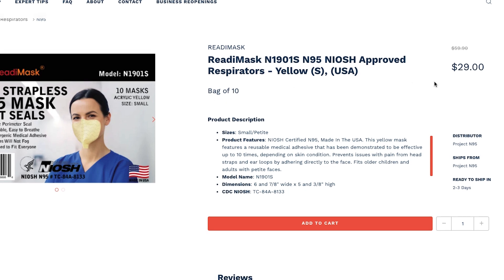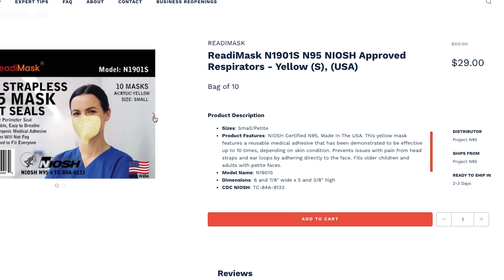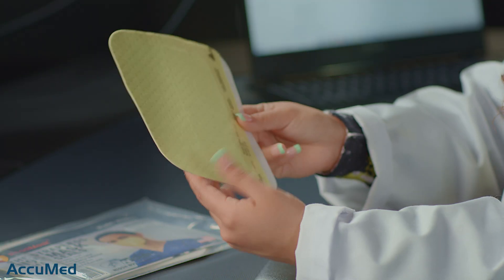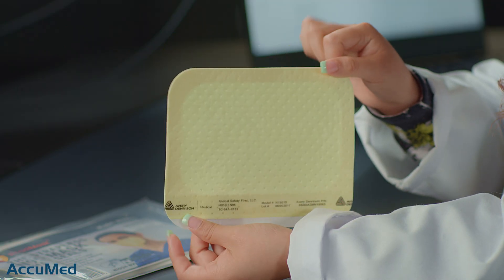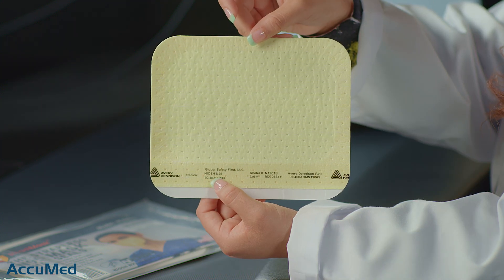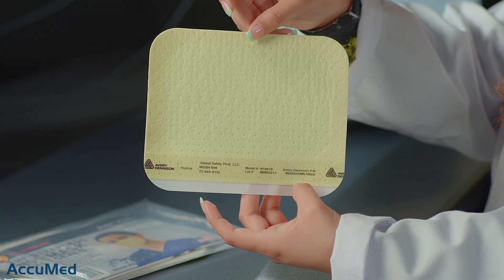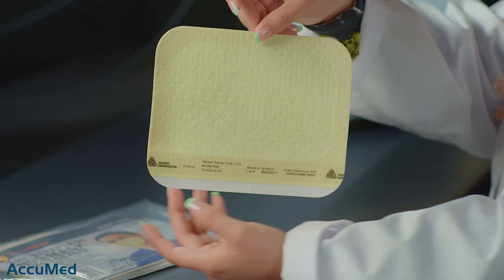They come in a pack of 10 for $29, which makes them almost $2.90 each. This listing doesn't have any ratings or reviews, so let's go ahead and try these on. This is how they look. I think this is the bottom and it goes like this. Here is the TC approval, NIOSH N95, model number, lot number, and of course the manufacturer.